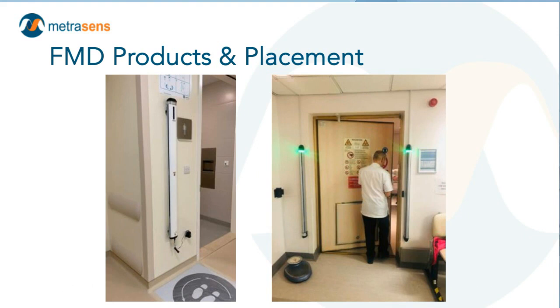Here we just have a couple of photos that illustrate the two standard formats, the screener single pole system on the left and the doorway type of system on the right. You'll notice that in this case we have the doorway swinging into the magnet room. For those of you who have been taught that for quench protections and entrapment protections, you should never do that.